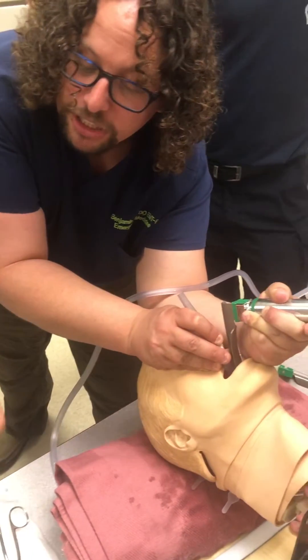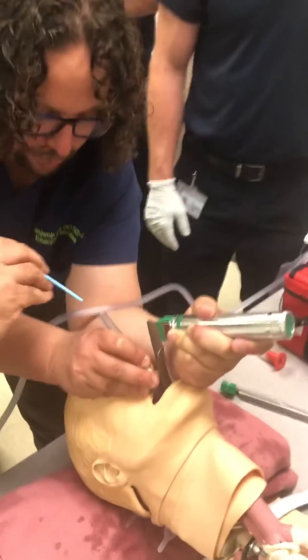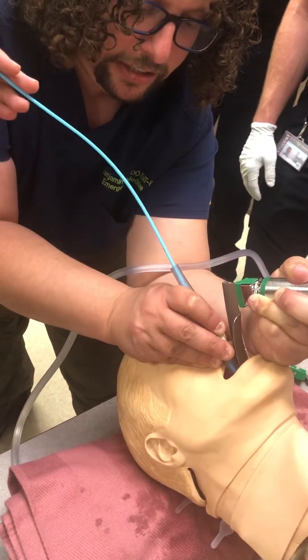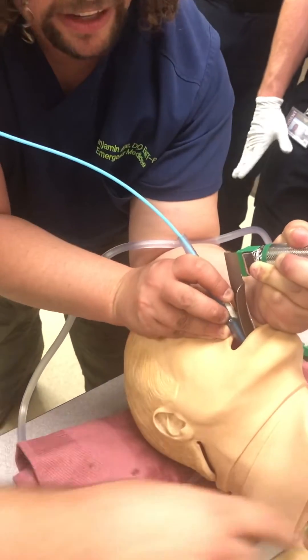Back into the bougie — back in. There you go, slide that in. Beautiful — slide it, keep going, keep going. Oh, it's there. Okay, cool.